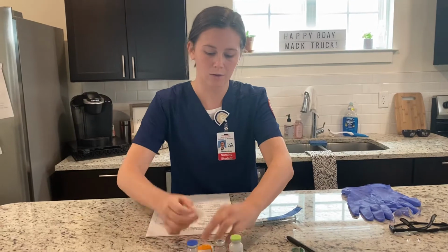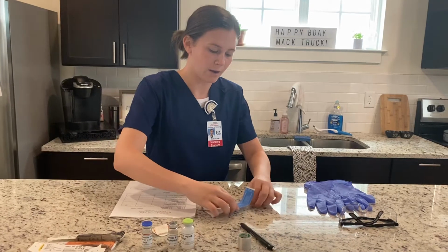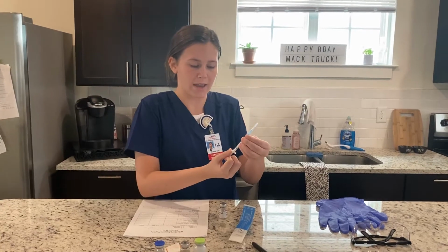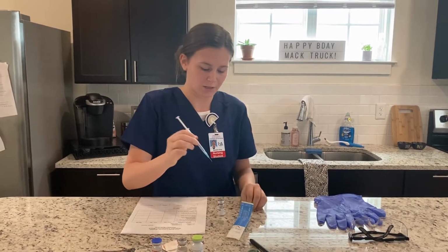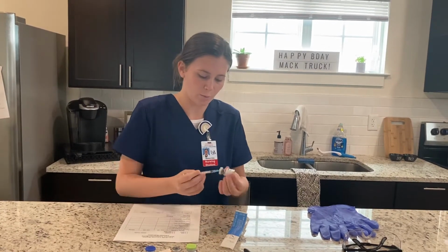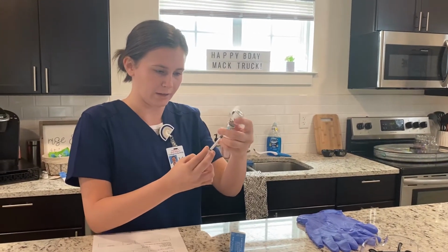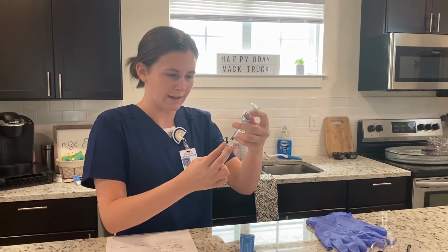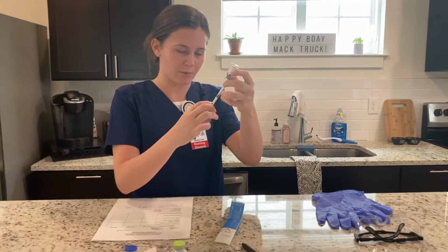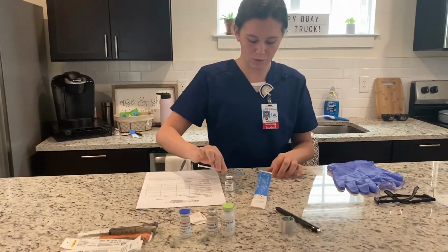I'm going to clean the vial, and then I will pull up about 0.5 milliliters of air, and then I will inject that into the vial. And then I will pull up a little more than 0.5 milliliters of heparin so that I can flick out any excess bubbles and then push it back to 0.5 milliliters. And then I'm going to recap using the scoop method.